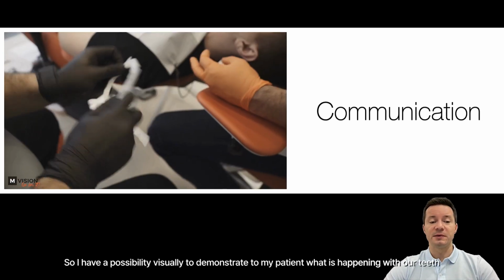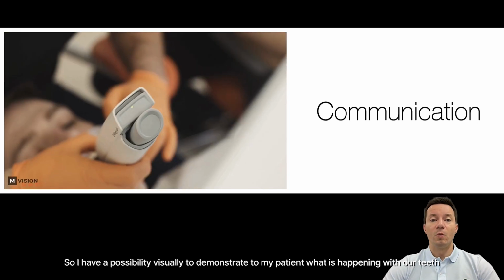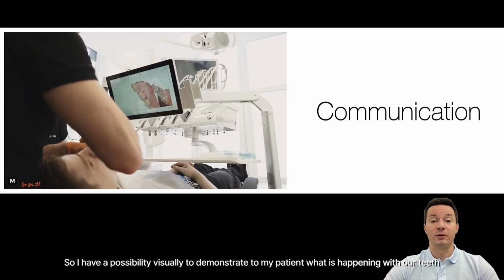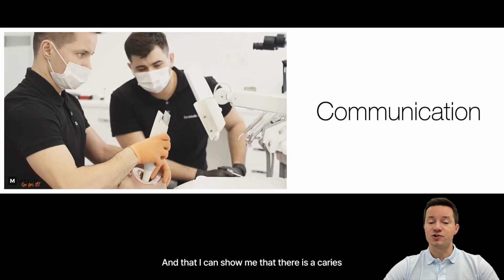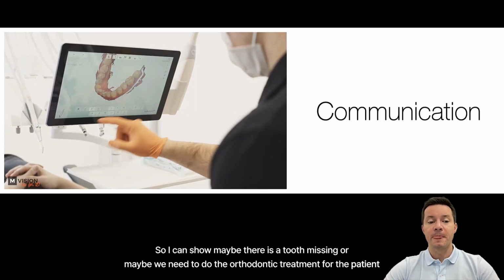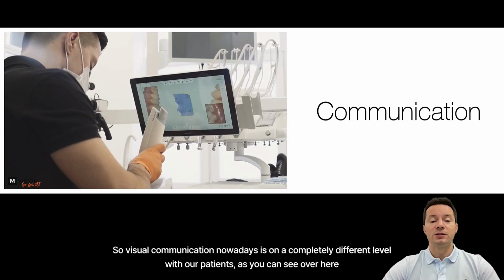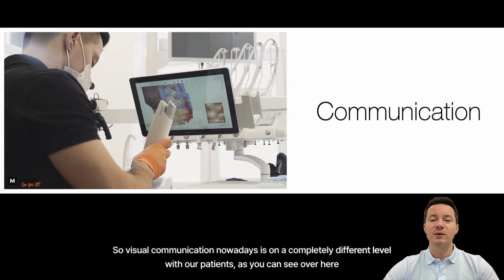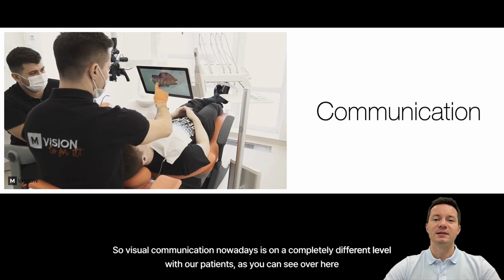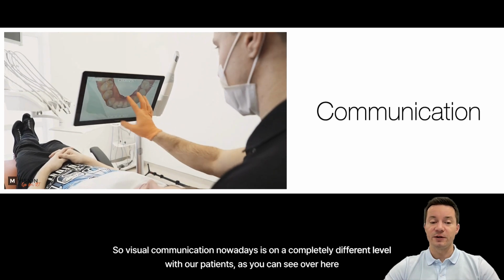So I have a possibility to visually demonstrate to my patient what is happening with their teeth. I can show maybe there is a caries, maybe there is a tooth missing, or maybe we need to do orthodontic treatment for the patient. So visual communication nowadays is on a completely different level with our patients, as you can see over here.